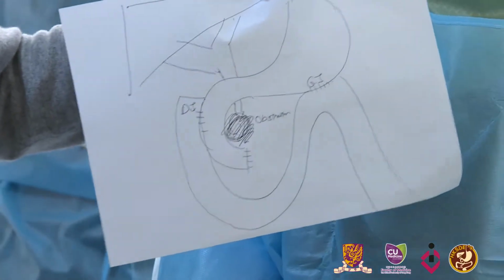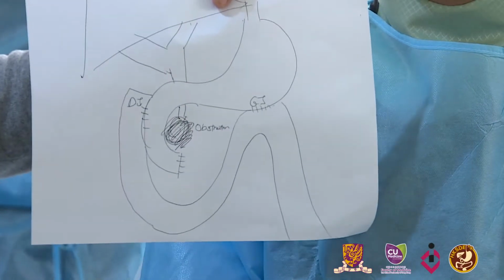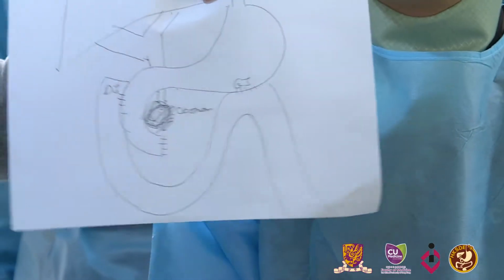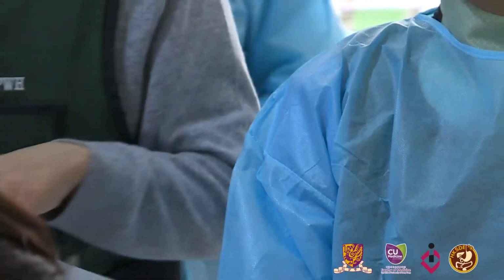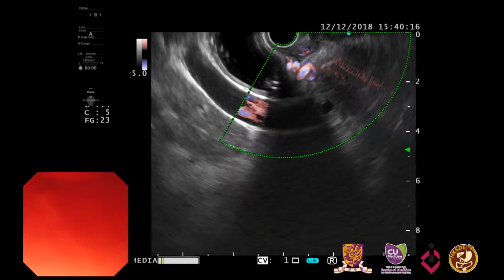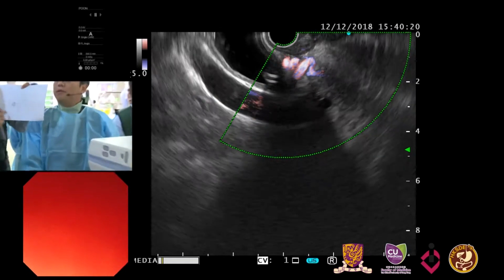What's the underlying etiology? He has a desmoid fibromatosis. It's benign, but it's a progressive condition. So he develops recurrent desmoid fibrotic tissue around this area. And why did the DJ not work? Because from the diagram, it's not like there was a kinking of the efferent limb.